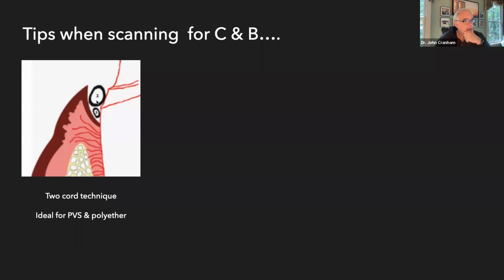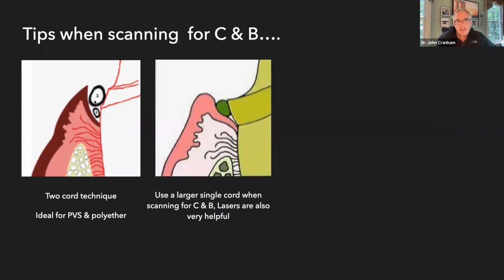What's important to understand is that with soft tissue, if the tissue collapsed over the margin a little bit, as long as the impression material got around the corner, you'd still have a good impression. But remember, with scanning, it is line of sight. If you have the 2-cord technique and the tissues go like that and the scanner cannot see the margin, your margin is going to be shy. So with scanning, we just put in one cord. We don't have to push it down as far, and all we really need is to expose just the tip of that margin.